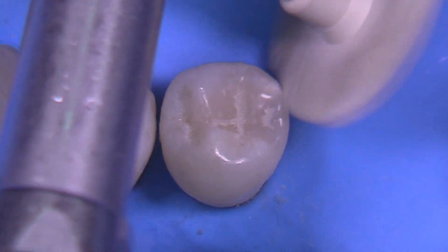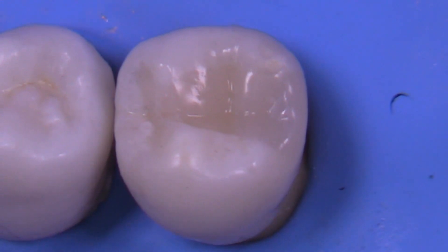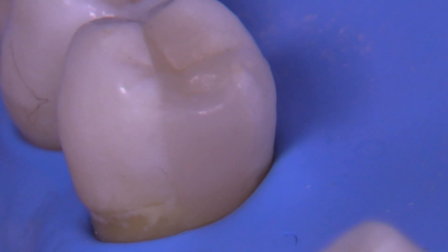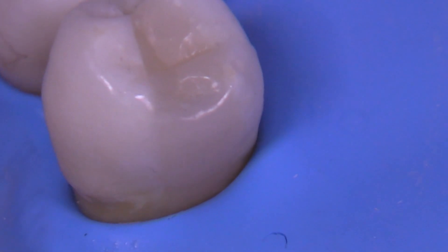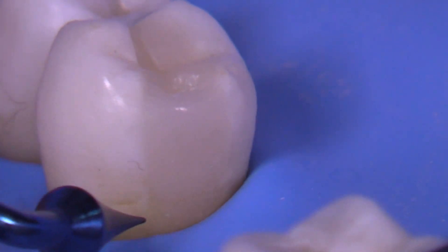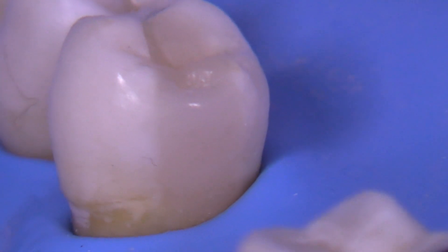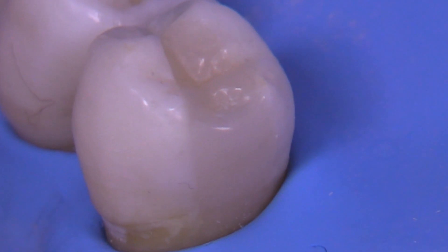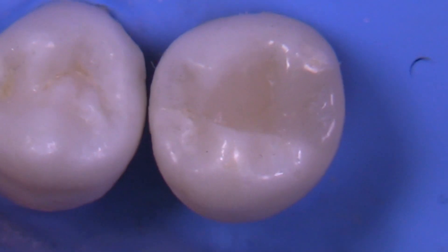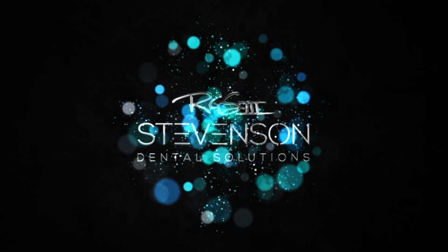By the time this composite is placed, the tooth is dehydrated and the composite takes on a less beautiful shade, but in terms of fit and polish, for a GAME procedure — a Gingivally Extensive Margin Elevation class 2 composite — we have an awesome result. If you're interested in the composite set, it is available for early purchase. You can reserve a set today for a major discount — follow the link in the video. Thanks everybody, take care.